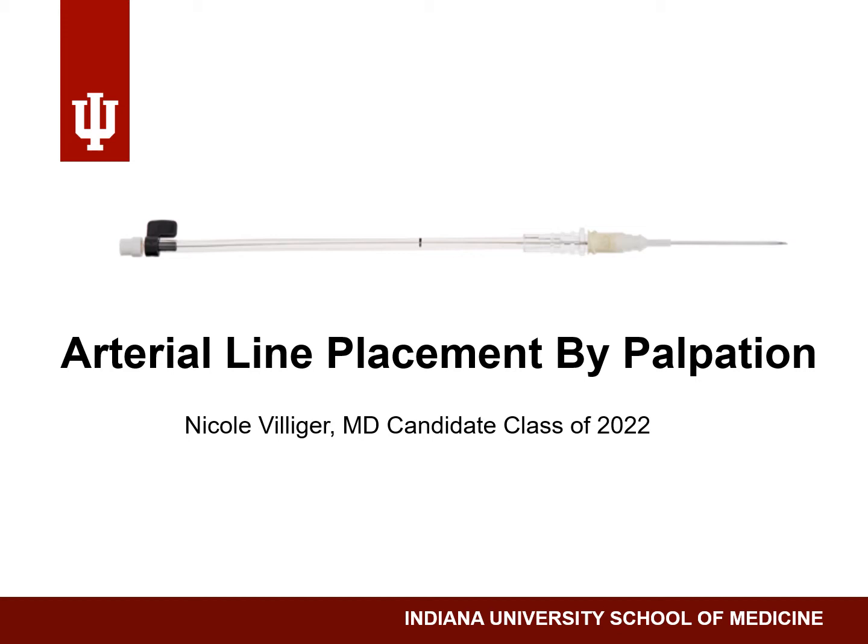There are many techniques and equipment options, including ultrasound-guided placement, but today I will stick to palpation-guided arterial line placement using a needle with a catheter and a guide wire, as pictured.